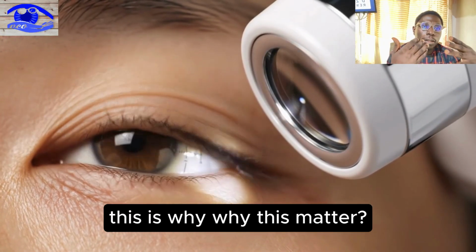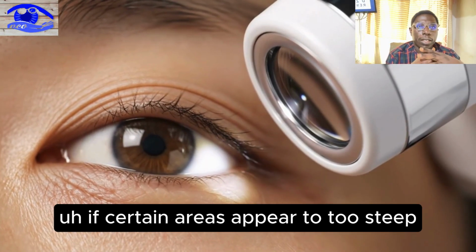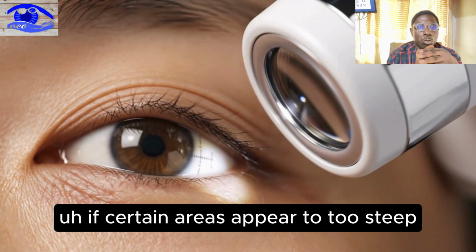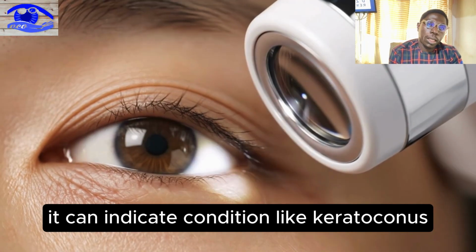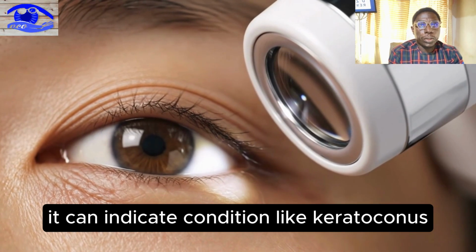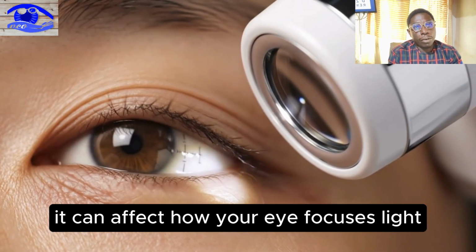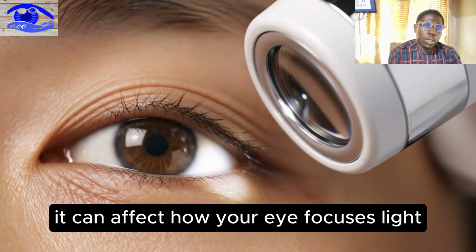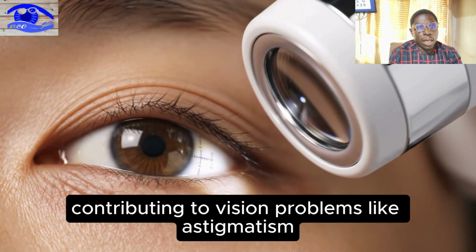This is why this matters. If certain areas appear too steep, it can indicate a condition like keratoconus. If areas are too flat, it can affect how your eye focuses light, contributing to vision problems like astigmatism.